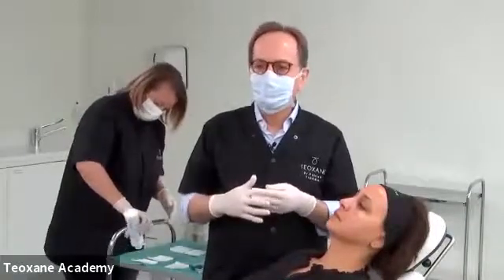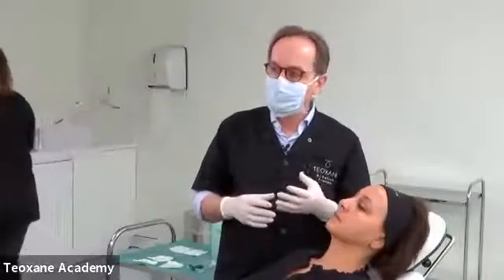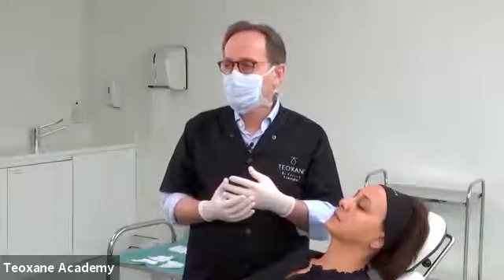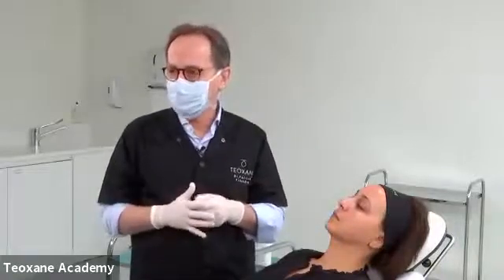So it means that if you use a smaller needle to inject Redensity 2, we didn't analyze the product that you get at the end of the needle that you will inject. So perhaps because you use a thinner needle, the product in the syringe will not be the same as the one you have at the tip of the needle. So my recommendation is not to use a smaller gauge needle to do your injection. Use the needle you get in the blister, because this is the needle where we perform all the tests, and the clinical studies are done with this kind of needle, not a smaller one. So this is my advice and the advice of the company.